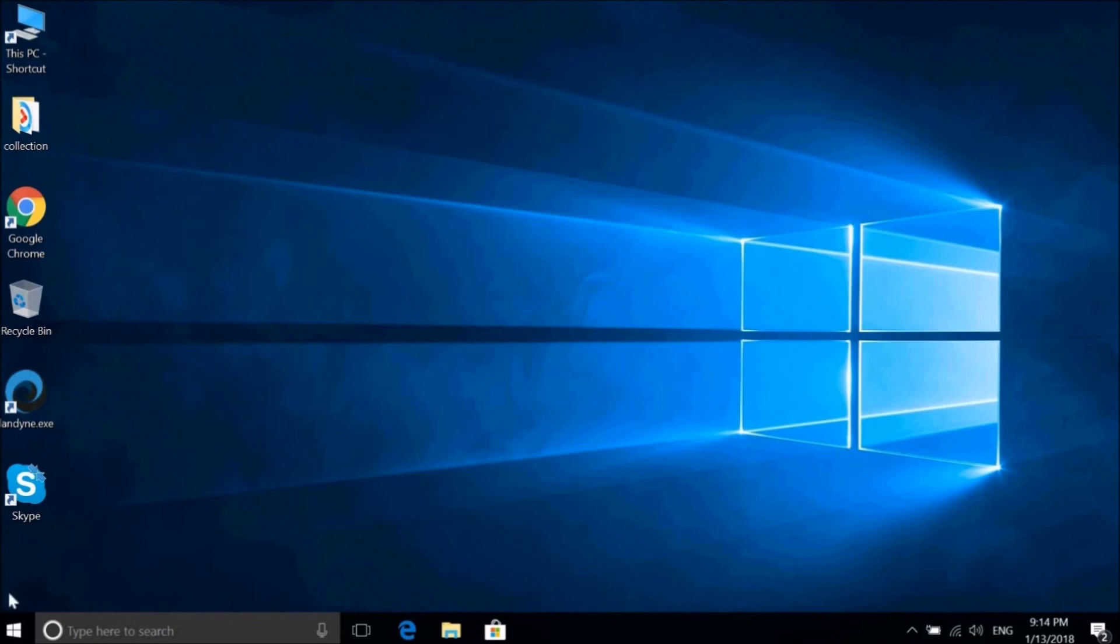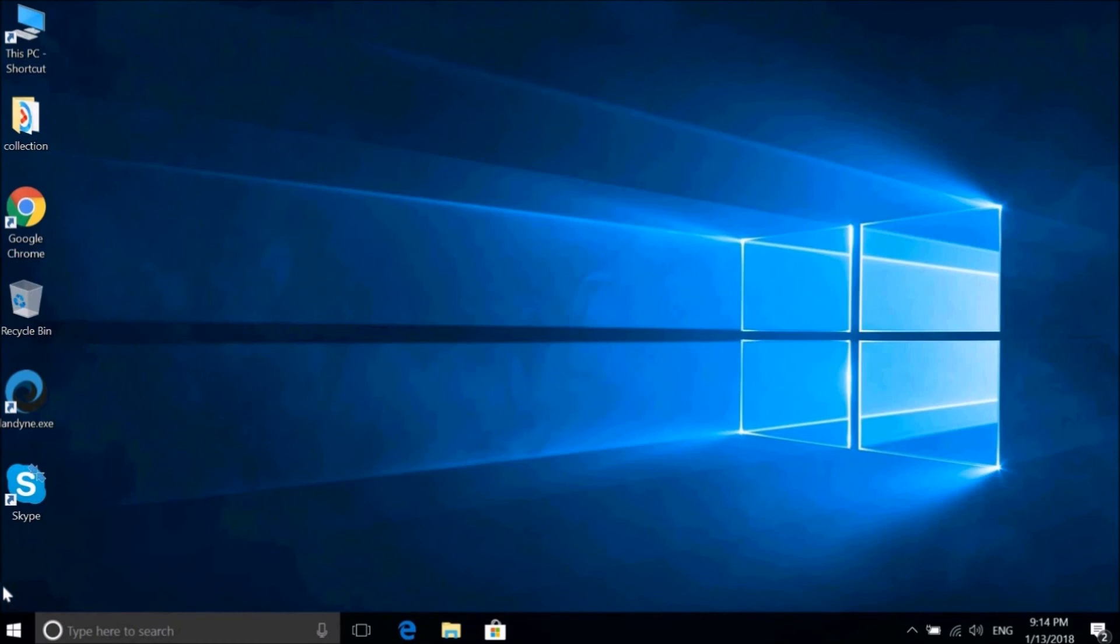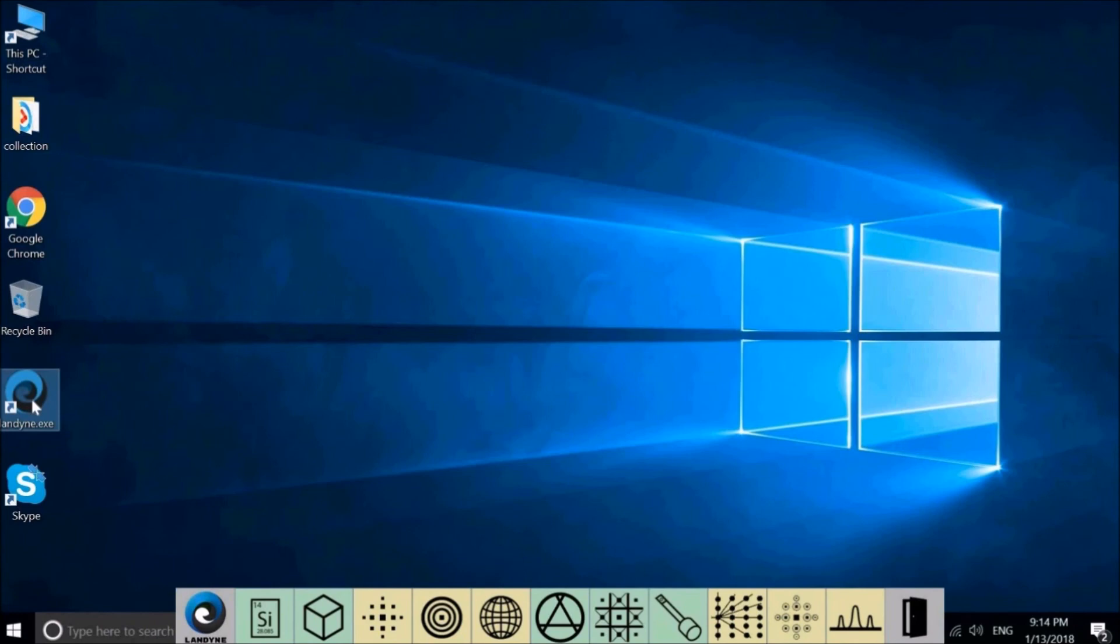The laptop I use now has a display resolution of 1920 by 1080. Here is the Landyne launcher icon. Double-click the icon. We have the Landyne launcher show up.